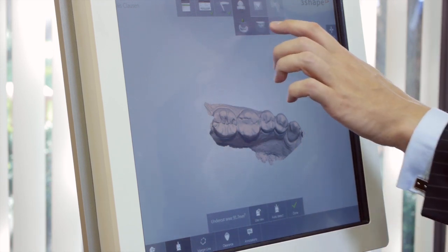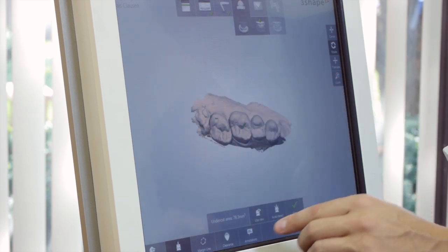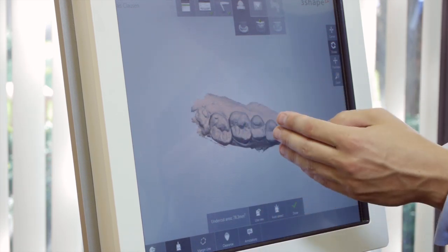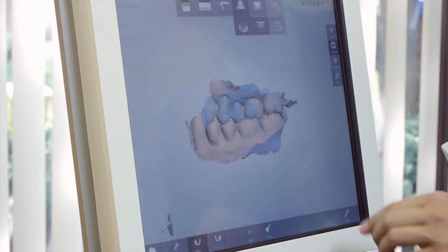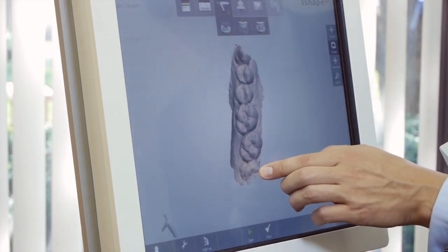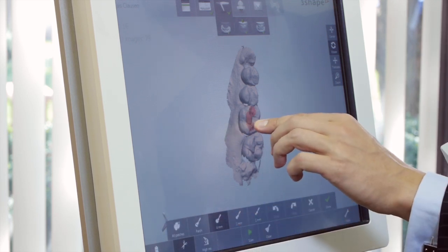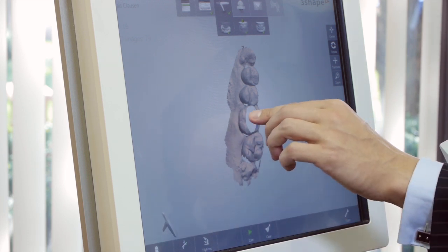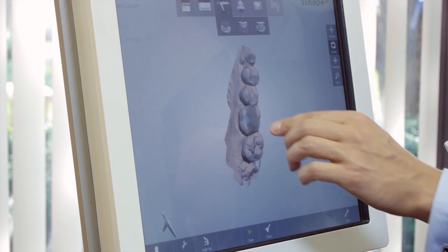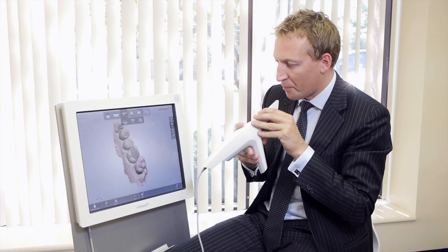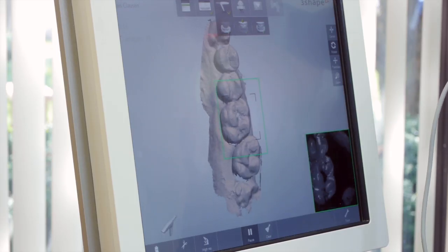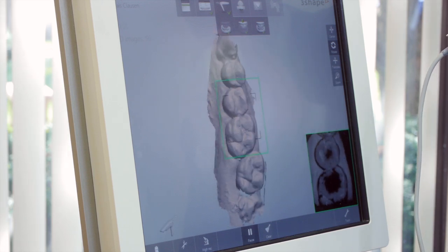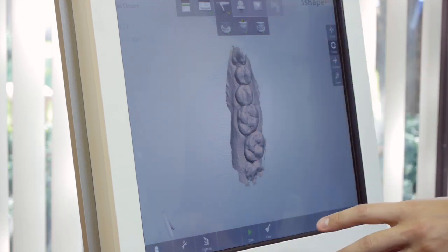Another nice feature is that let's say on the upper jaw that you had a prep. Now I don't have any preps really here, but if you want to go back and re-scan or you want to prep more and then scan again, it's very simple. You go back, click on the upper jaw here, like this, and then you can take away, basically you trim away here like a part of the prep. Let's say it was the prep. And then you want to, obviously, prep a little bit more on the patient, and then you want to come in and do a little bit of scanning from there. So then you can easily go back. And then directly fill in again here, so you don't need to re-scan the whole situation.